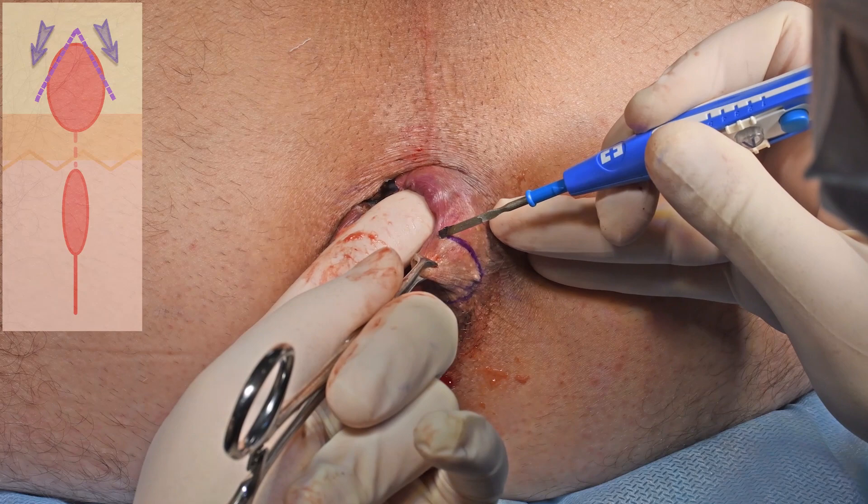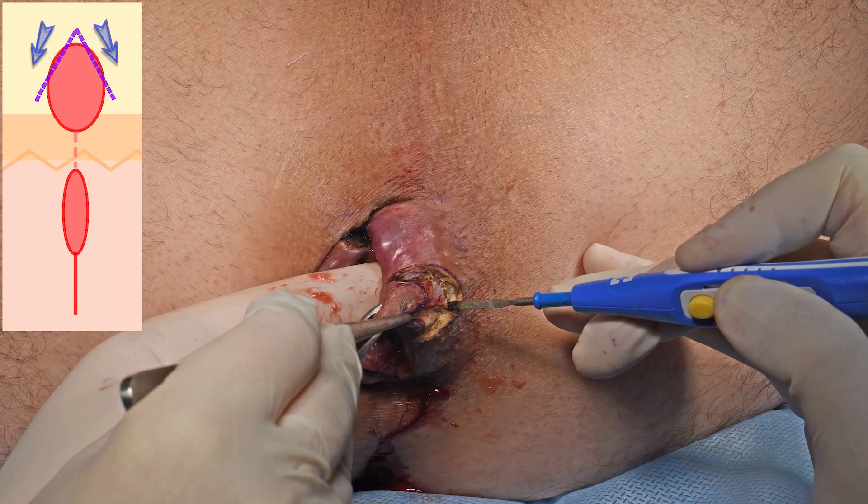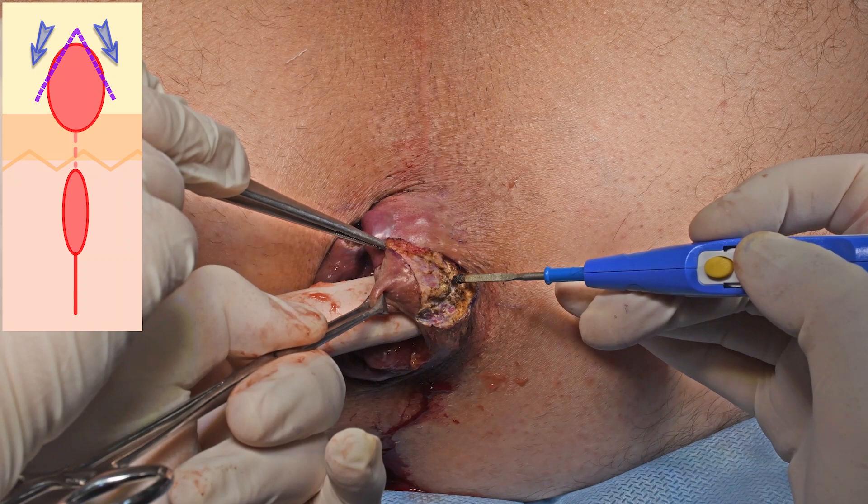The incision line of the anoderm at the base of the left lateral complex is marked. The mucocutaneous bridge between the two wounds is preserved, and the surgeon continuously controls this with his index finger. The size of the excision wound should be equal to or less than the width of the mucocutaneous bridge to prevent stricture.